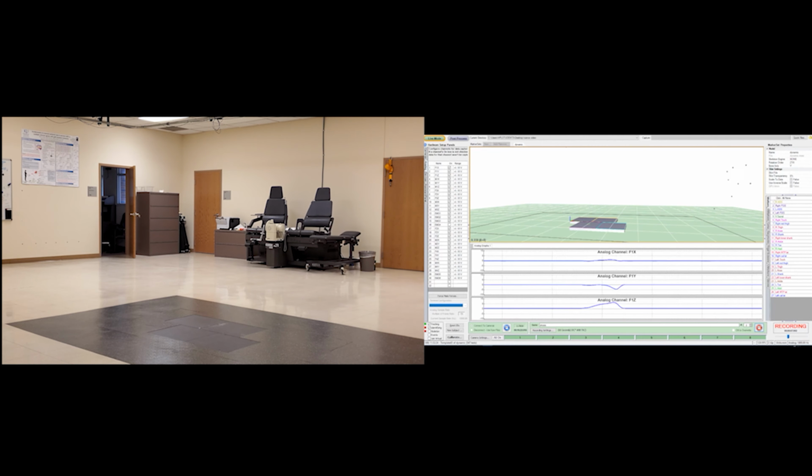We'll always look at the change in force production in the context of when during the gait cycle the change in force is occurring. The gait cycle is basically looking at the profile of one step as it crosses the force plate. There are 3 main phases in a typical gait cycle. Those would be heel strike, mid stance, and toe off, and each of those can be affected differently or the same depending on what sort of neurological effects the subject has that's modifying their force production.